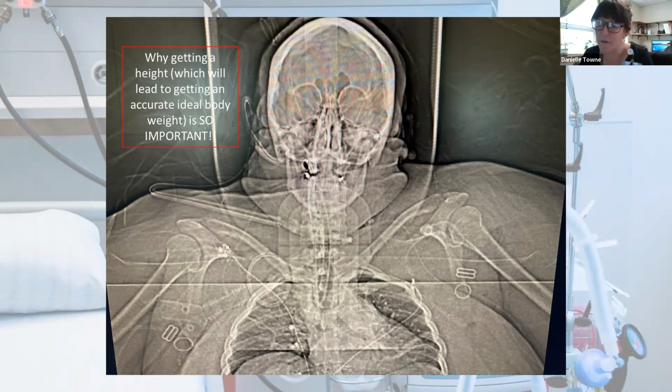So once we drop that tidal volume down to the appropriate range, it's easier to ventilate, her SpO2 improved, her end tidal decreased, everything got better. So just remember, just because a patient's larger doesn't mean their lungs will be. And you can clearly see here that you can't guesstimate the size of somebody's lungs based off of the size of them. So please don't. Always measure their height, get a good number, and then come up with the ideal body weight and get your information from there.